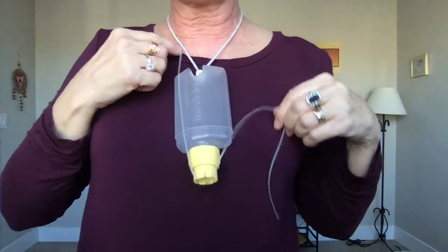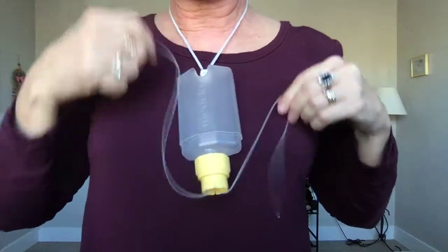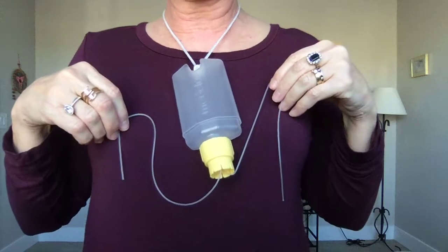And there you go. So the regular SNS looks like this. It's got 2 tubes, and the reason for that, it's also got this, so you can wear it around your neck, and it's got these little clamps all around. So the way you can use it is if you want to put one tube on each nipple, you can do that. I actually have moms use it a little bit different.